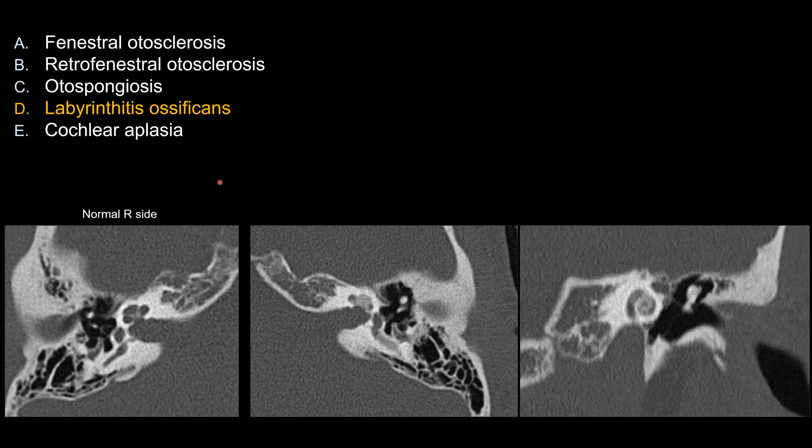Remember the history here is very helpful because they talk about left-sided hearing loss. So you can assume that the right side is the normal side for comparison.